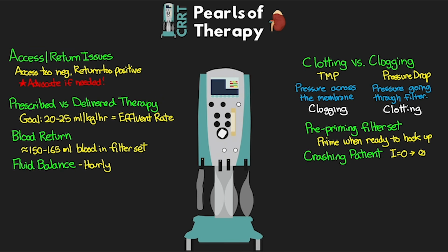Now, speaking of codes, if your patient does actually code, then you want to turn your blood flow down as low as it goes.